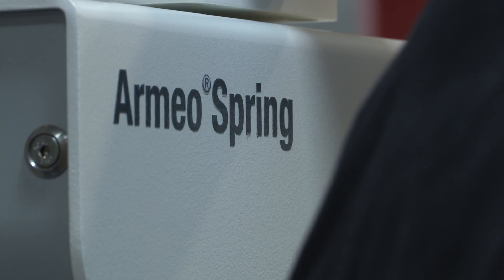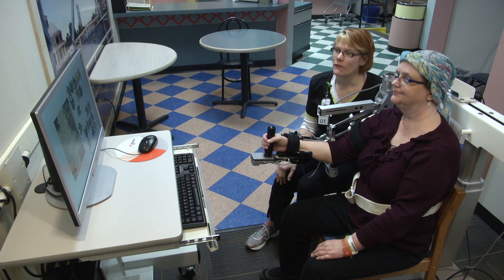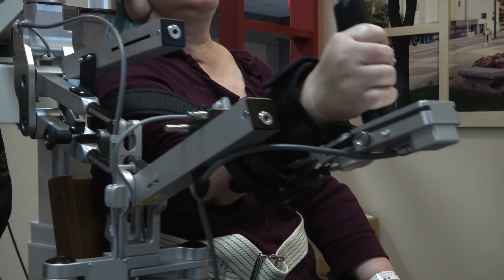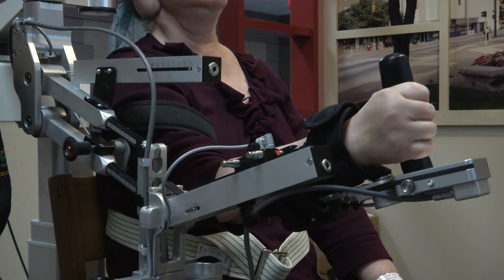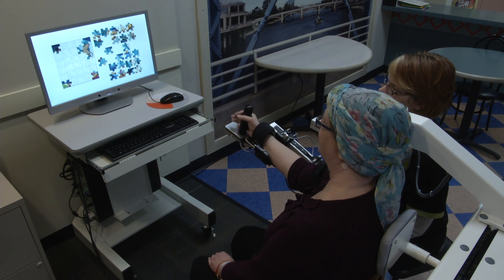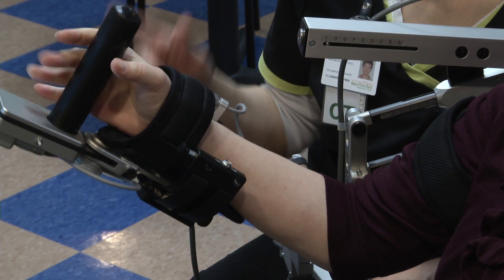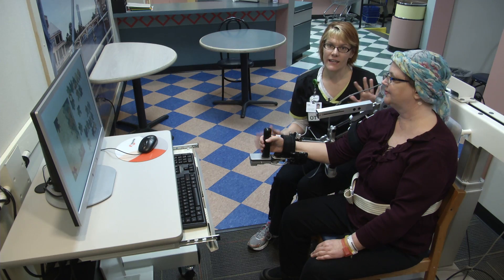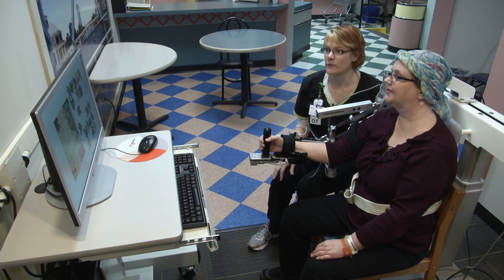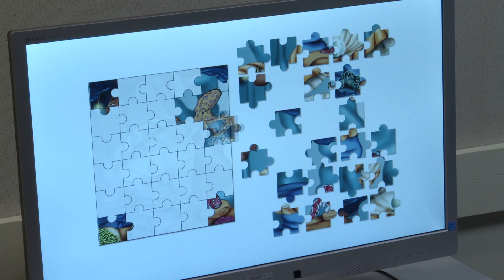This is the Armeo Spring and the goal is to help people who have limited range of motion of their arm be able to experience more range of motion actively with their arm. This machine helps eliminate some of the gravity pull on the arm and helps her calibrate her movements a little bit better to reach targets that we want to achieve functionally with shoulder flexion.